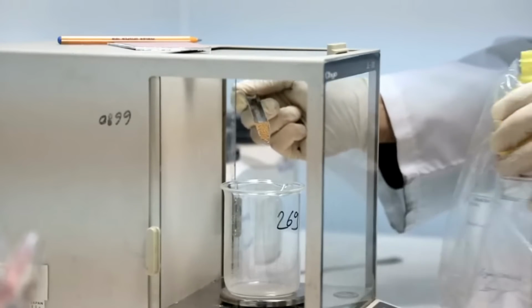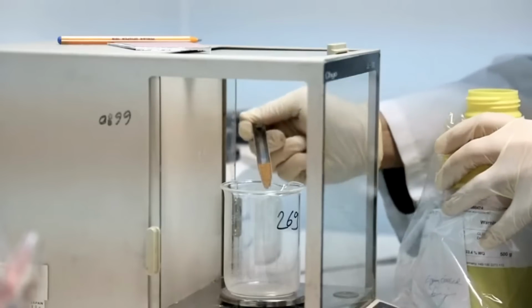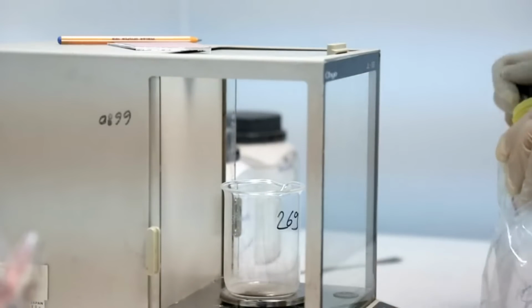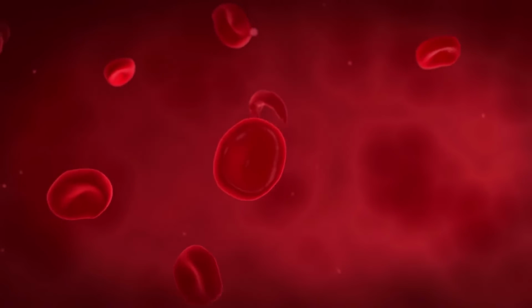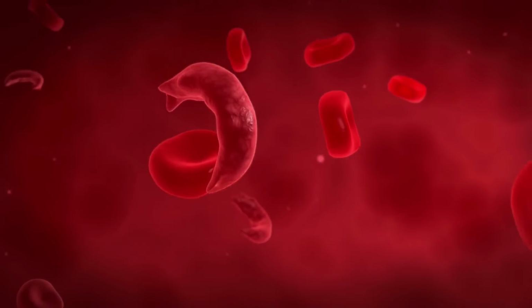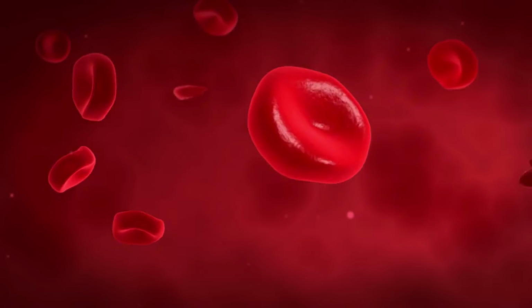Proper specimen collection and preparation is also vital for accurate microscopic analysis and diagnosis. Let's look at some key techniques. Blood smears. Gently place a small drop of well-mixed blood at a 30 degree angle on a slide and spread with another slide, let dry and perform staining protocols as needed.